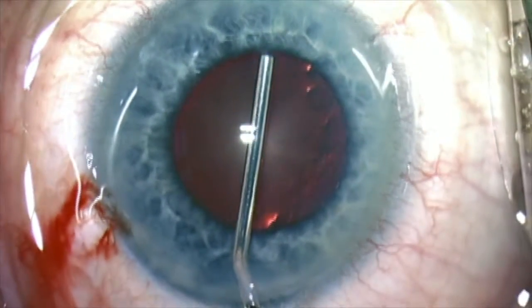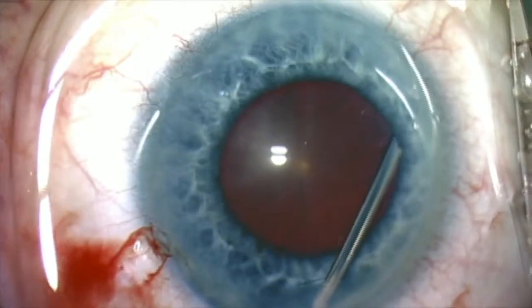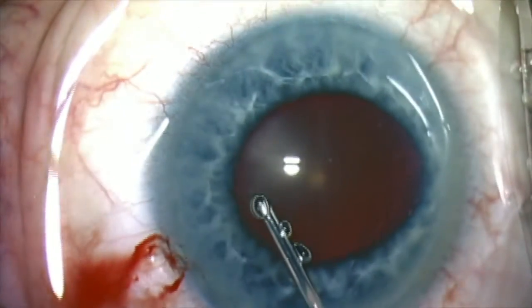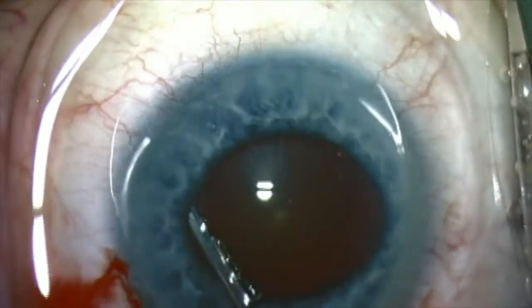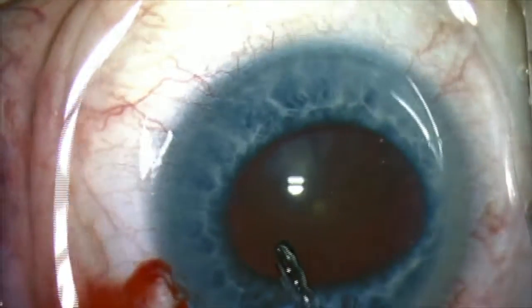If the pupil is inadequately dilated at the start of the case, it's only going to get worse as the case progresses. Therefore, it makes better sense, if you're considering a pupil dilating device, to put it in at the start.